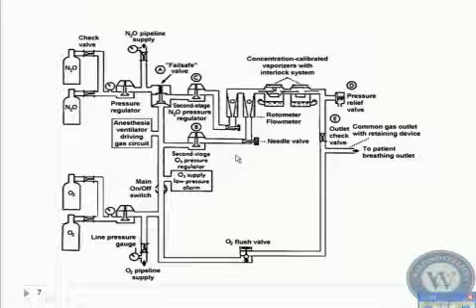So on the oxygen side, we have two pressure regulators. All right, the first pressure regulator is here, which reduces the PSI from about 2200 on a full E cylinder down to 50. And then the second one is right here. So this pressure regulator on nitrous and on oxygen sits in the internal housing just beneath the flow meters. All right, so when you look at that picture and you see the flow meter, your second pressure regulator is just before you turn your flow meter on.